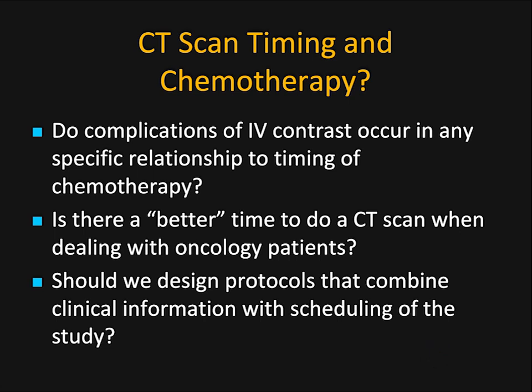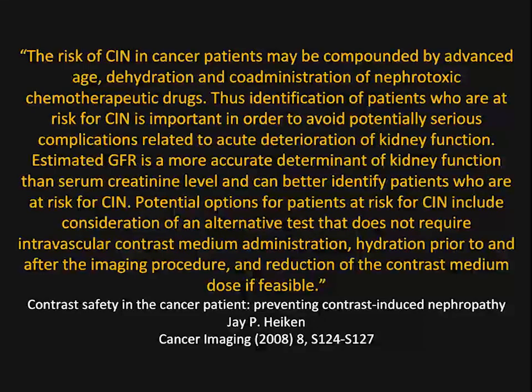Is that the way to do it, or should the patients come a different day, and should you spread the studies apart? I know it's inconvenient, but what's the safest thing to do? Should we design protocols that combine clinical information with scheduling of the study? Is there a best time to do the study? These are all very good questions.